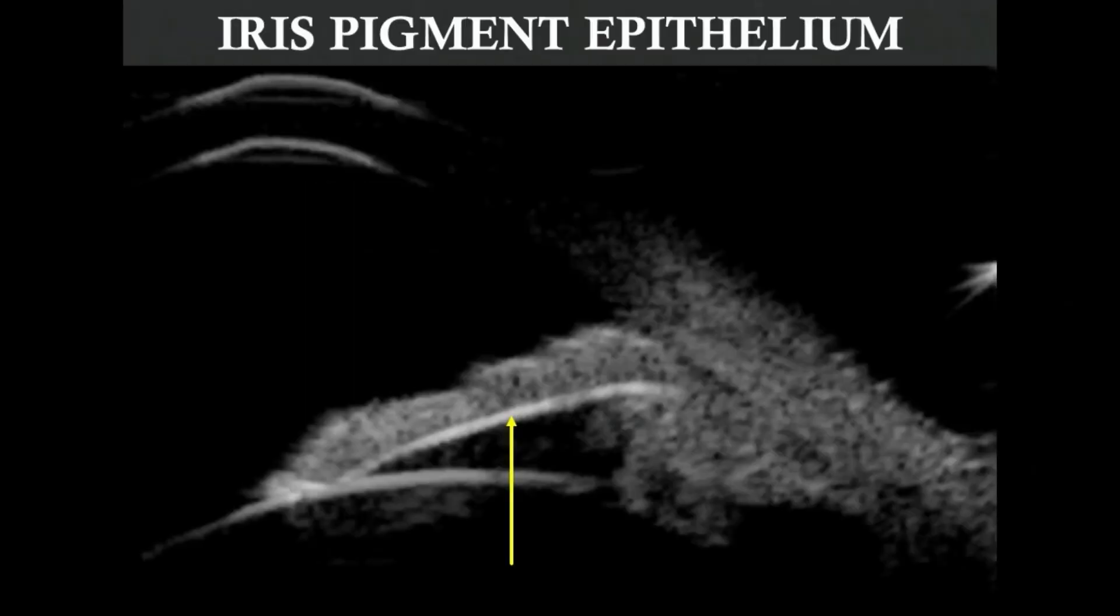The iris epithelium can be imaged as a hyperreflective line on the posterior surface of the iris. The UBM image also shows the relationship of iris margin to the anterior lens surface.